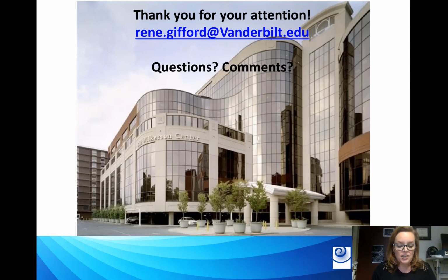So I think you want to be thinking about in your practice how you're using your ECAP responses, and if you're using ESRTs, and if not, before we meet for our live course, I really encourage you, I want you to take at least one patient, get their ECAPs, and then measure ESRTs across the array. And I want you to think about the relationship between those thresholds for ECAPs and the ESRTs and how that might help you program that patient.